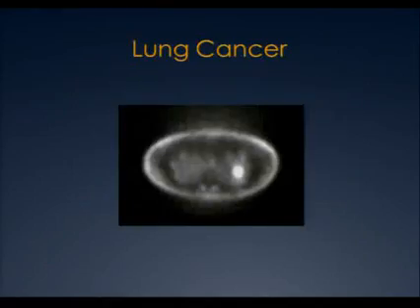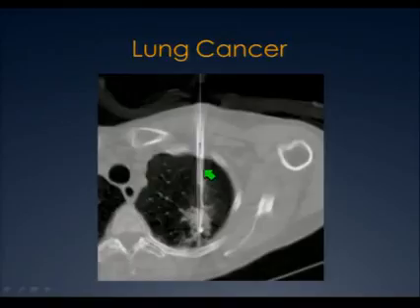Lung cancer. I treat lung cancer at our place by ablating tumors in the lung. This is a PET scan, obvious hot lesion in the lung. Now, I'm going to show you two pictures. This is an RFA probe stuck into that lesion. I also had to biopsy that lesion, and although it looks really easy, oh, you just take that and stick it straight in there, it ain't so easy.